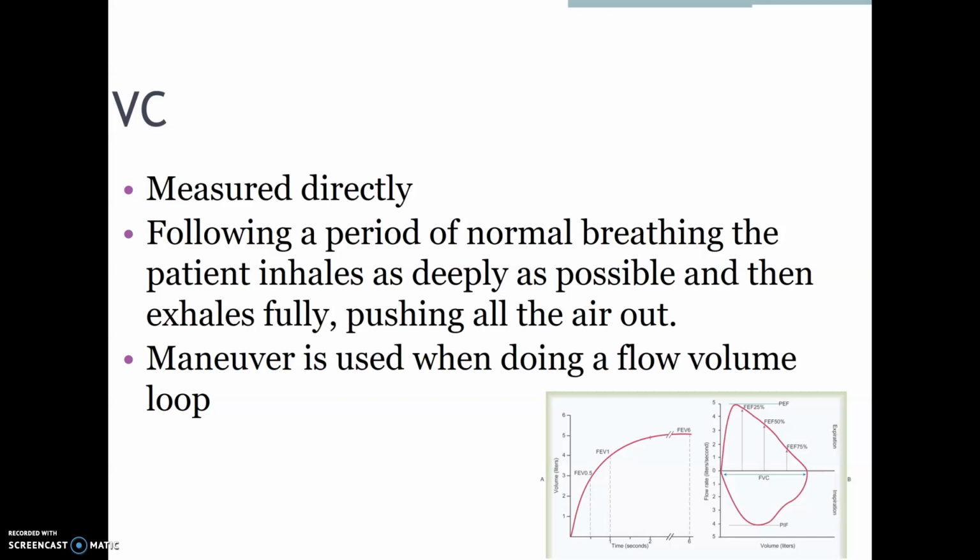So if you follow my tracing here, the patient's going to take a deep breath in and then blow all their air out, keep going, keep going, and then they'll take another deep breath in. So that's how a flow volume loop would look, and we'll talk more about flow volume loops in the next few slides as well.